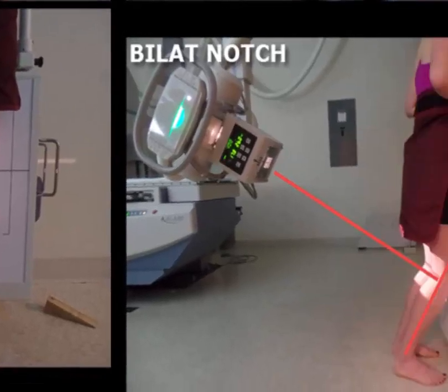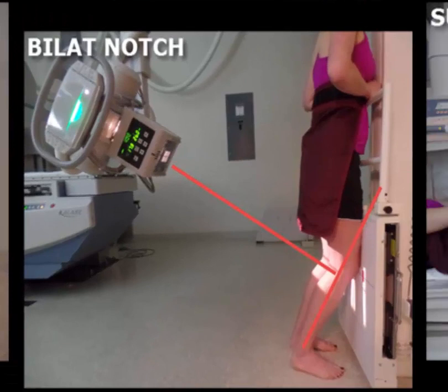Next, let's look at the bilateral notch views. These also will be done standing today. The one thing to note about notch or intercondylar fossa views is these can be done many ways. Today, we are going to look at the PA upright version. It is important to understand the concept of the notch view. The most important process is to ensure that the central ray is perpendicular to the tib fibs.